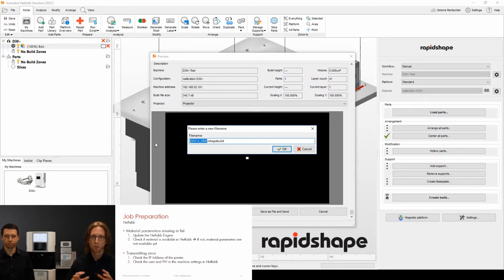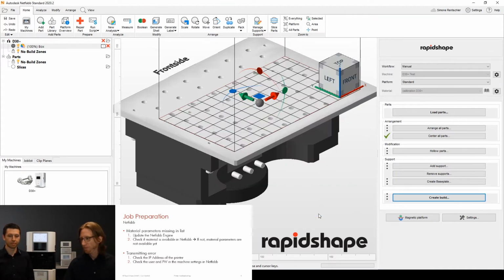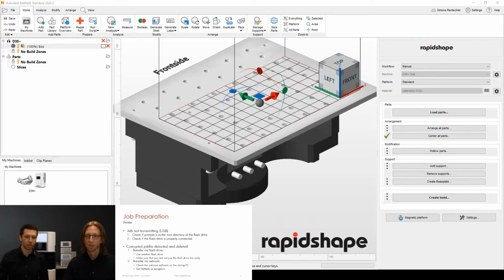So this was all about transmitting errors. I can see that there's no further question, but I also think that this topic is pretty straightforward, not too difficult to do and to understand. So for this case, I just cancel because, as you can see, this is a small cube, so we do not want to print this part here. So I just go back and I would just move forward with the next topic. Yes, with Robin. That's fine.